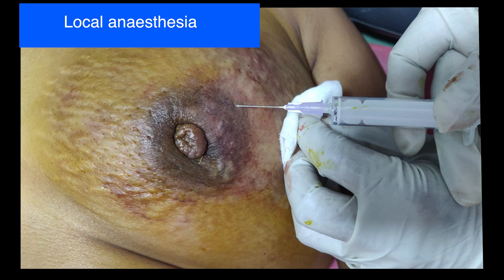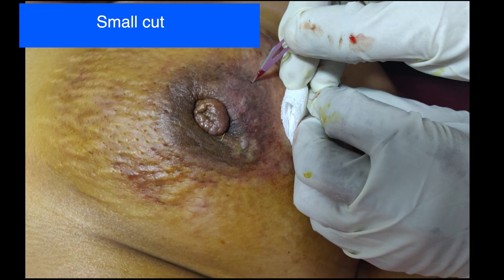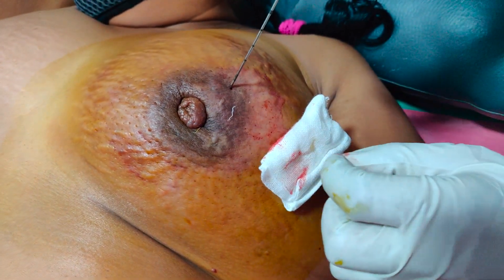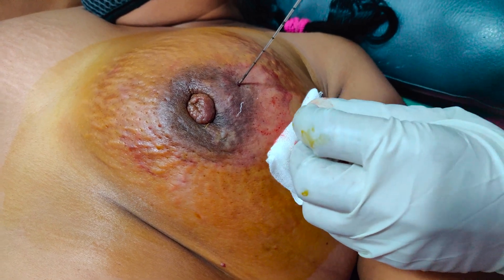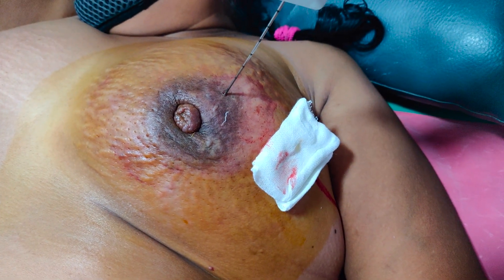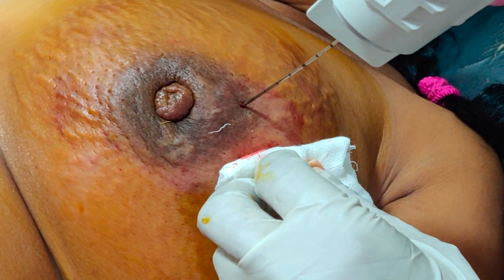Here, we are performing core biopsy for a suspicious breast lump. Local anesthesia is given before the procedure. A small nick is made on the skin roughly at the center of the lump, and through this incision, I am placing the core biopsy needle to reach the surface of the lump roughly at the center. Once I am satisfied with the positioning, I will fire the gun.